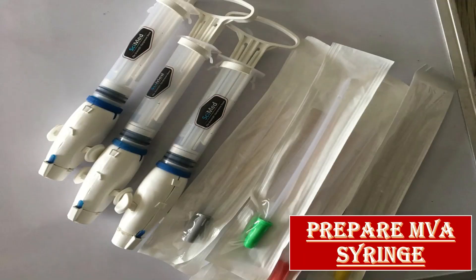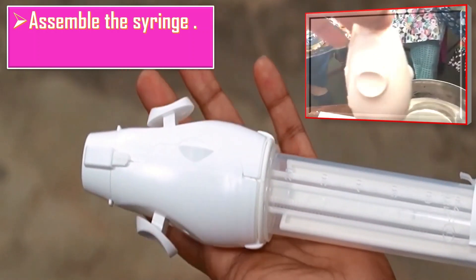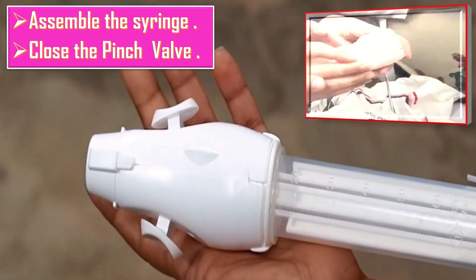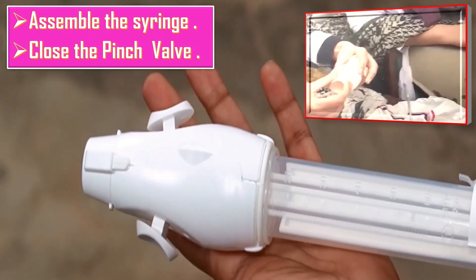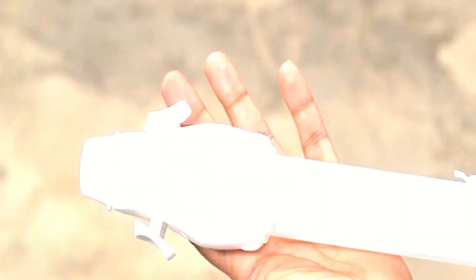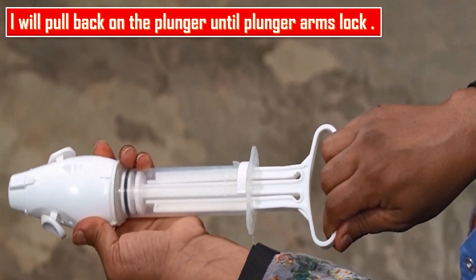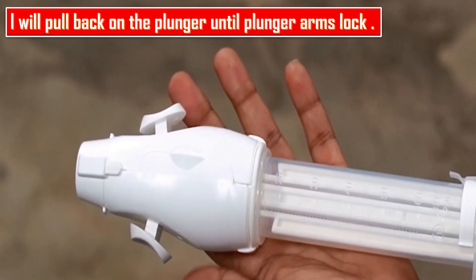Next comes the preparation of the MVA syringe. I will prepare the MVA syringe when the uterine contents are likely to be copious, making sure I have three syringes ready for use. I will assemble the syringe and close the pinch valve. In the short video on the top right corner you can see how to assemble the syringe. Then I will pull back on the plunger until the plunger arms lock.